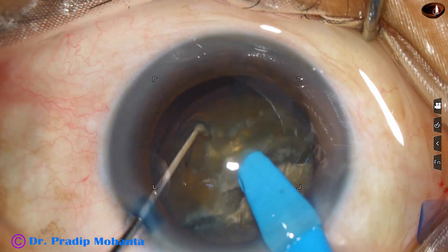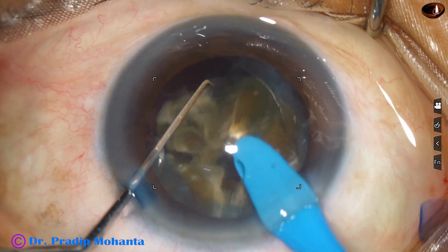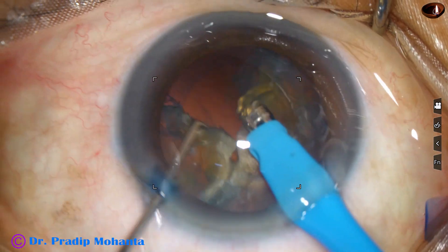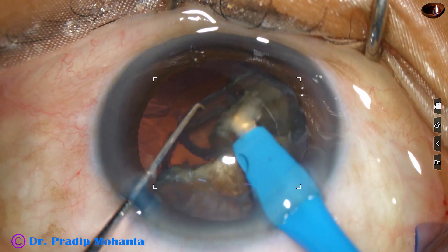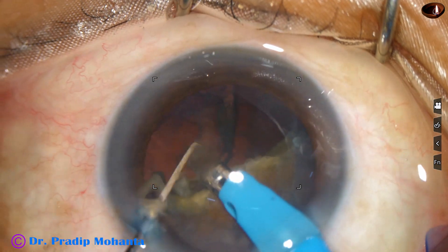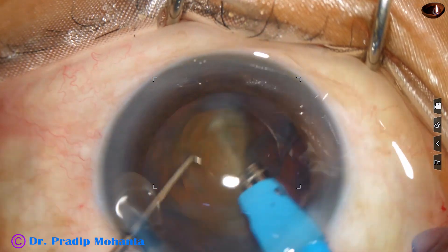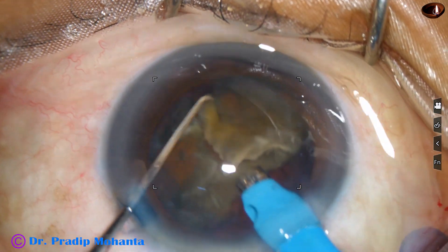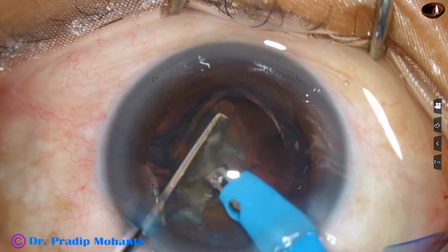Now each hemi-nucleus is divided in the same way — the phaco needle goes through it. Each large fragment is tilted so the apex projects towards the anterior chamber, and emulsification is started from the undersurface of the apex. If necessary, we can subdivide these small pieces. This is the other hemi-nucleus; it is also divided into 2 pieces. Now each nuclear piece is emulsified.